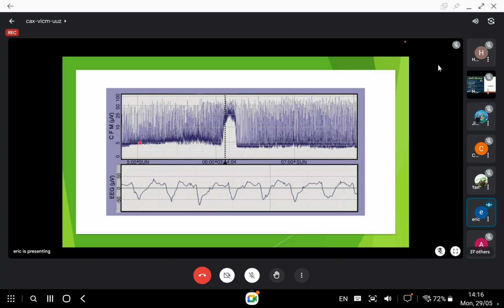So on the aEEG, when do we suspect that the baby might be having seizures? It is when you see, like this, the background activity is nice like that, consistent, and suddenly you see a capping, meaning that the minimum and the maximum go up and then come down. Okay, and then it continues on with the background activity. So we would like to put our cursor here, and scroll from the beginning until the end to see what is happening here. You can see this is very repetitive, right? Okay, so that is very, very classical of seizure activity.